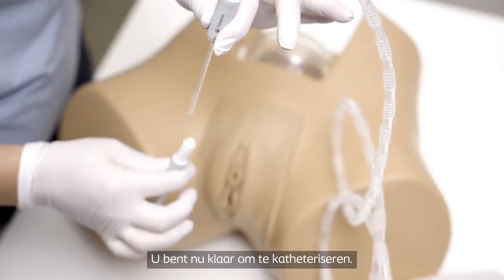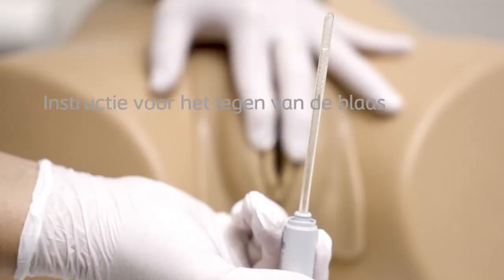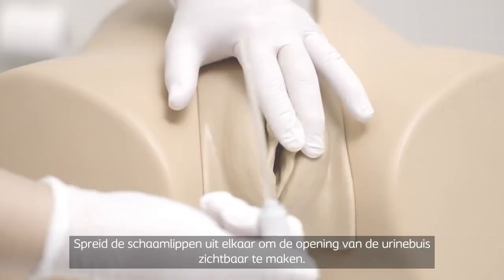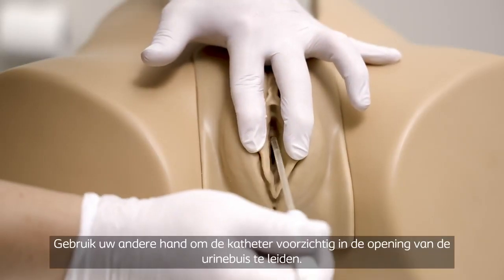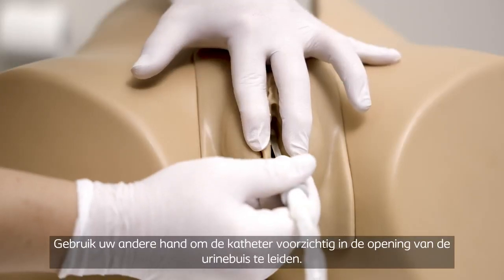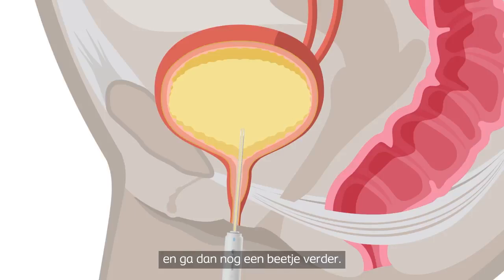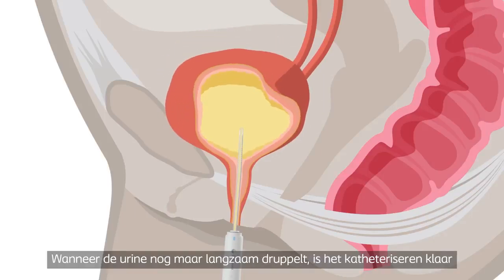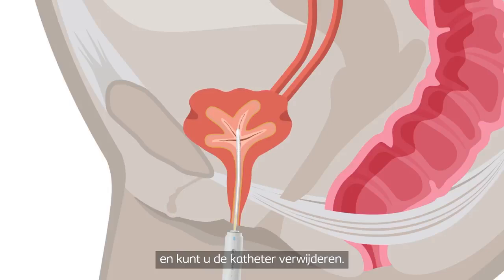You are now ready to perform catheterization. Spread the labia apart to make the urethral opening visible. With your other hand, slowly and gently insert the catheter into the urethra. Continue to insert until the urine starts to flow and then a bit further. When the urine begins to drip slowly, the catheterization is complete and you can remove the catheter.